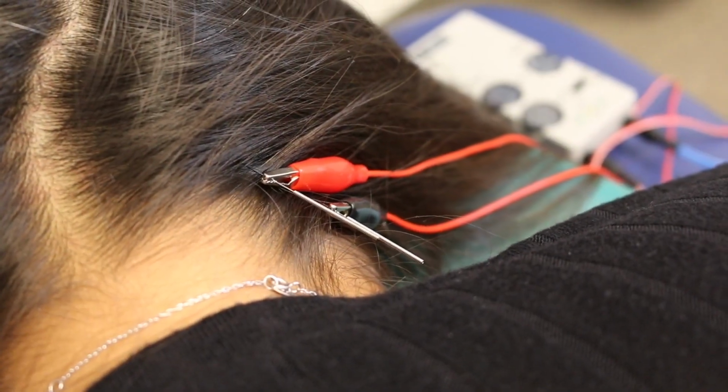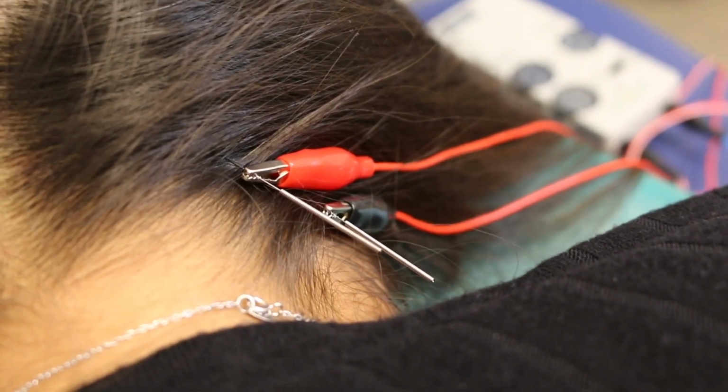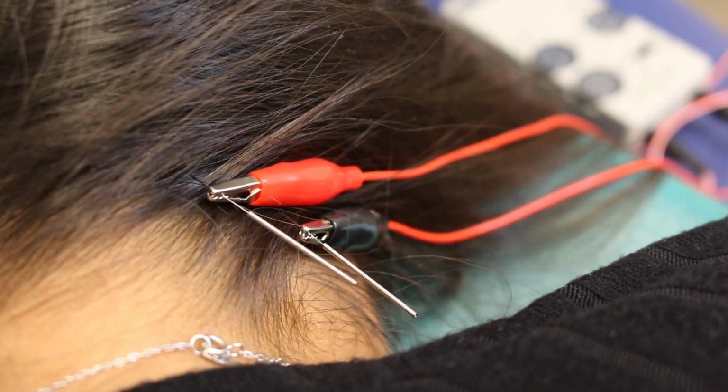We had our patient on here for about 5 to 10 minutes. As soon as it was done, what we would do is turn off the electrical stimulation, take the needles off, and set the patient up.